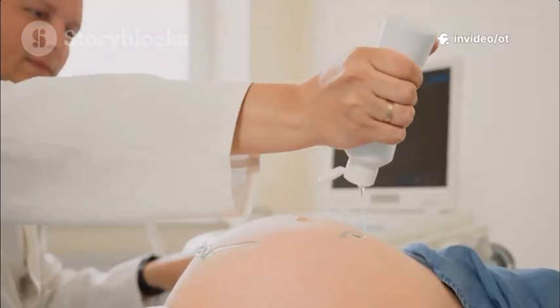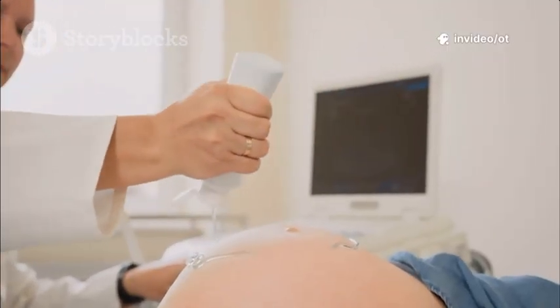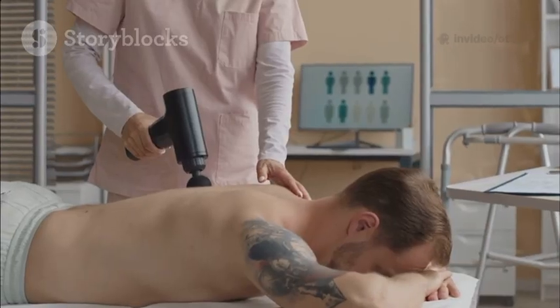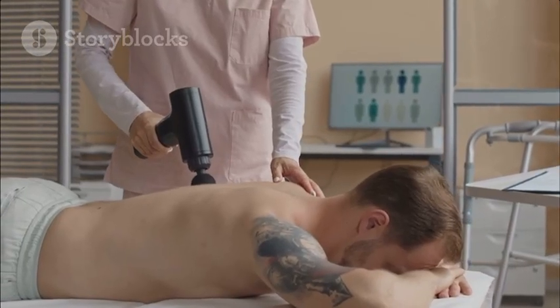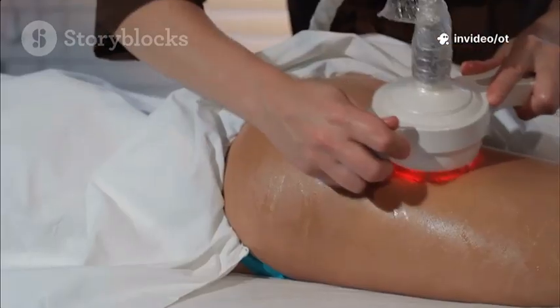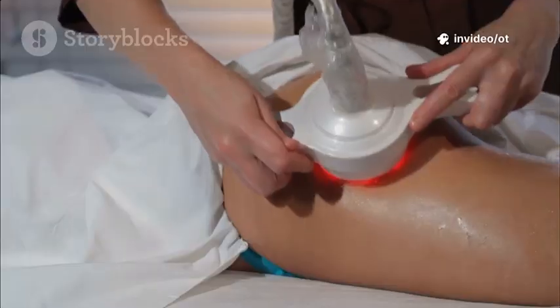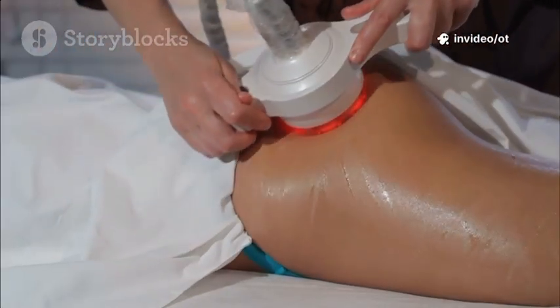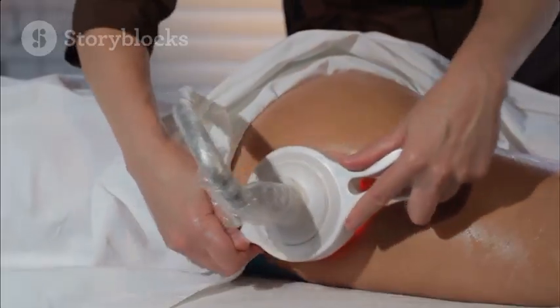Use crushed ice, gel, or commercial packs with a thin, damp cloth between cold source and skin. Treat 10-20 minutes per session. For acute swelling, repeat every 1-2 hours while awake. Warn patients: they'll feel intense cold, then aching or burning, then numbness. Stop if treatment extends long past numbness.